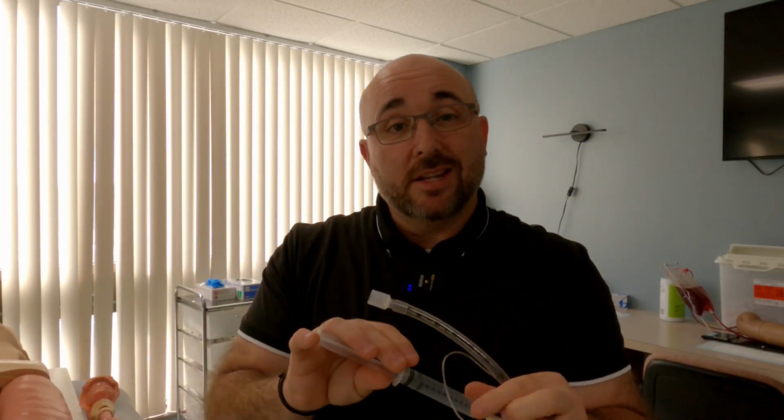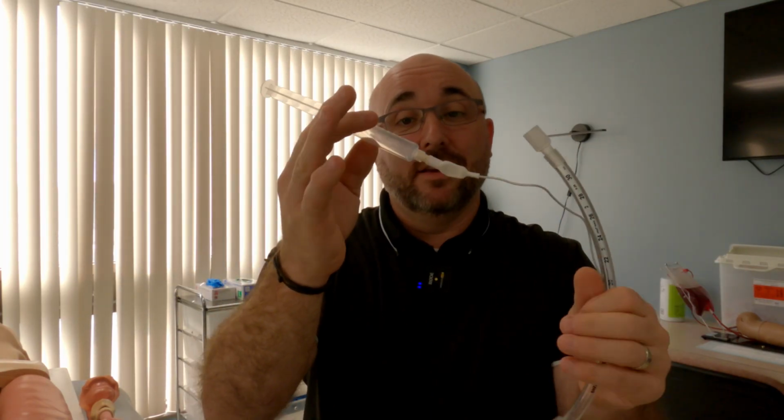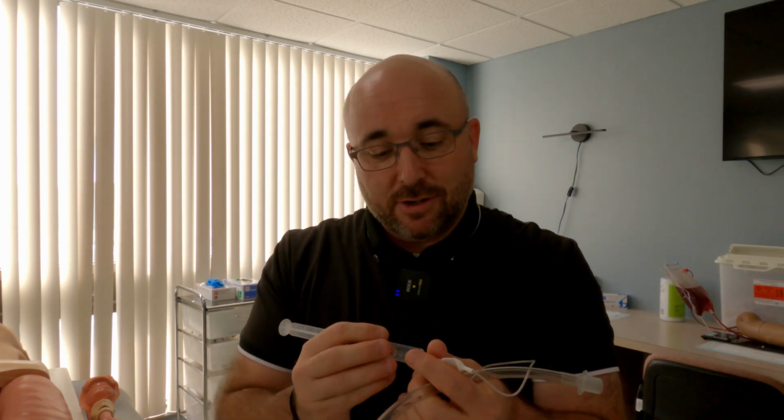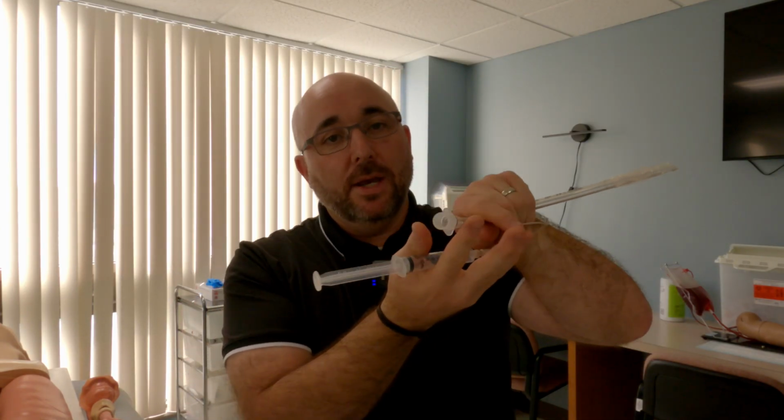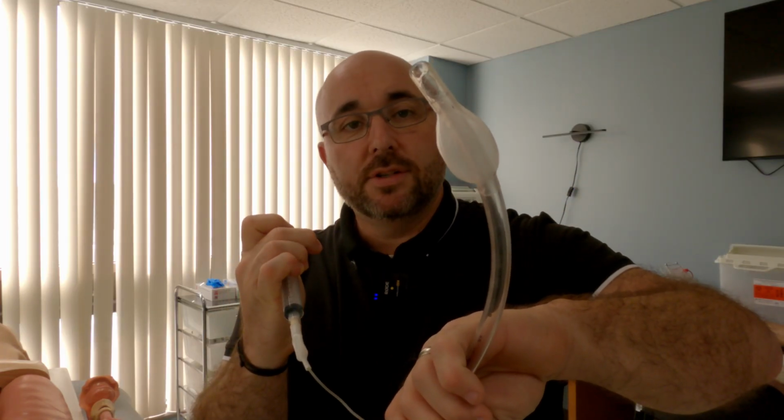I usually, and it's personal preference, leave the syringe attached, because after the tracheal tube is in, sometimes you're fiddling a little bit to try to get that attached. I usually leave it attached. So this entire piece will still be in the package. The top might be opened up. You've checked the cuff. You see it holds air.